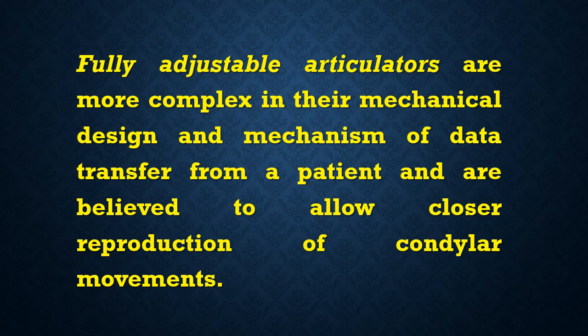Well, the fully adjustable articulators, you will not use them, but for your knowledge, it is a complicated instrument, and it has a complicated design, and the transfer of records from the patient is believed to allow closer reproduction of condylar movement.